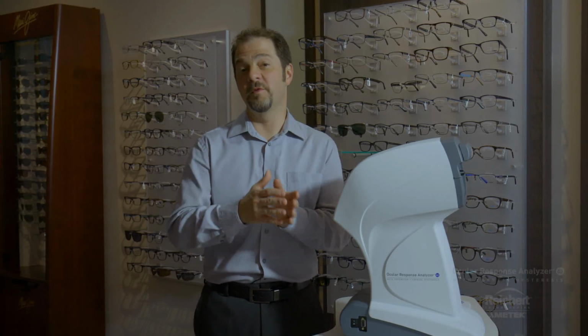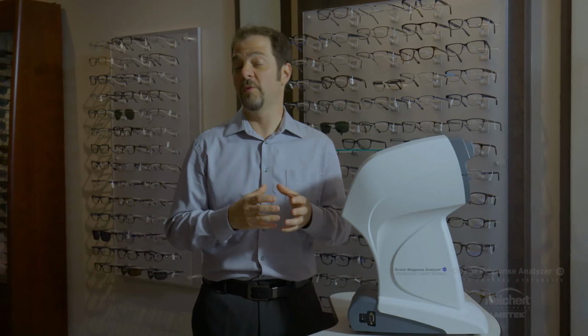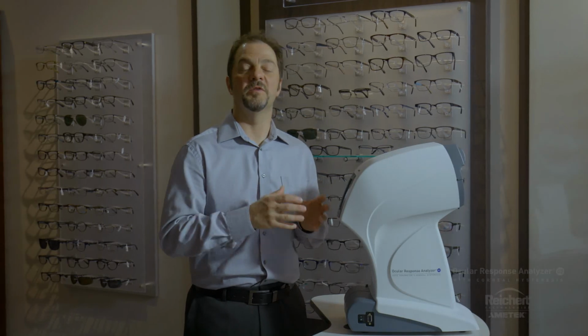So it's possible if you measure one eye and then measure the other eye, that you catch one eye at the peak and one eye at the trough of the cardiac cycle, and this can cause an actual pressure change. And because this measurement is so rapid, it captures that actual pressure change. So you're looking at a difference that really occurred due to the ocular pulse. If you think this might be the case, go ahead and make multiple measurements, and the intelligent averaging system should average out those ocular pulse related pressure changes.